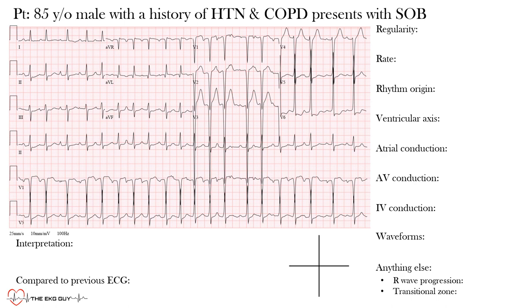Before we get started, let's review the approach we've been using to interpret the EKG. We have the patient's clinical presentation and the EKG below it. On the right side of the screen, we have a list to go through: first, regularity of the rhythm; then heart rate; rhythm origin; ventricular or QRS axis; atrial, AV, and intraventricular conduction; waveforms; and anything else such as R-wave progression and transitional zone. Then we make a final interpretation and compare to a previous ECG.